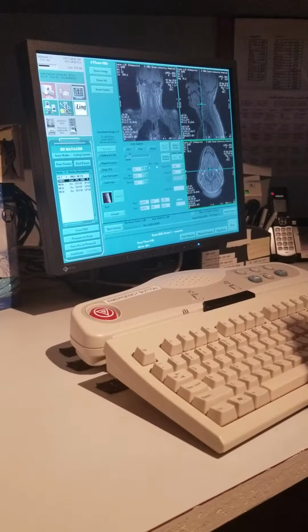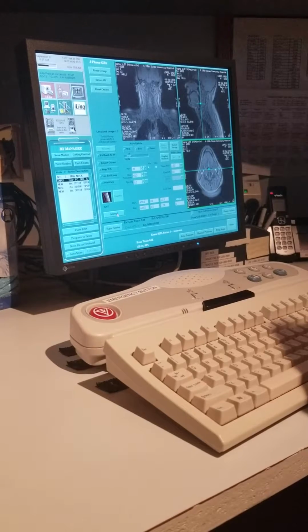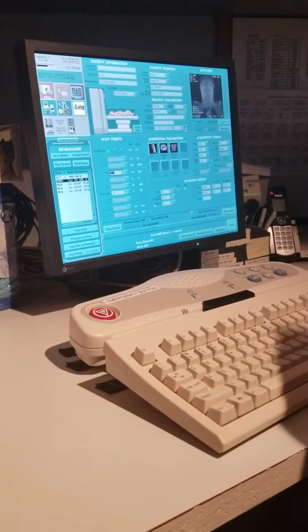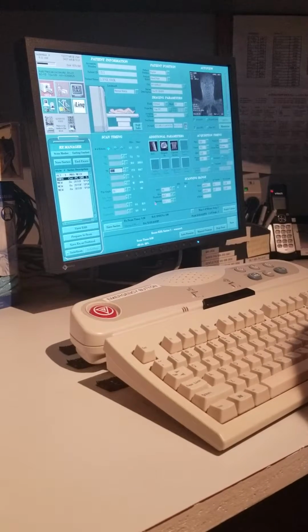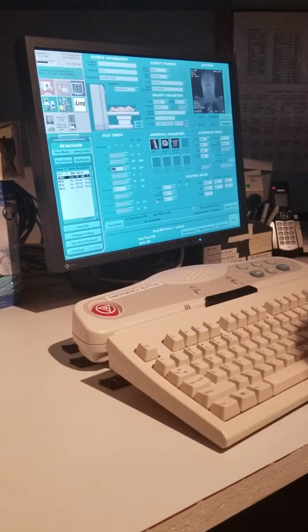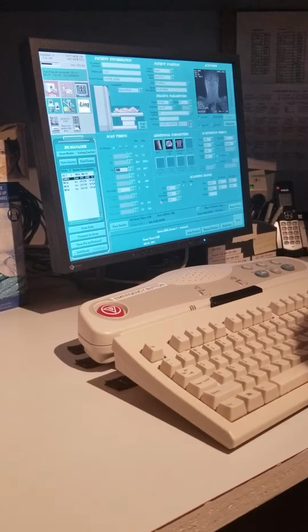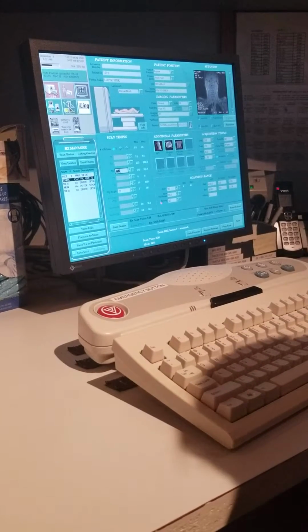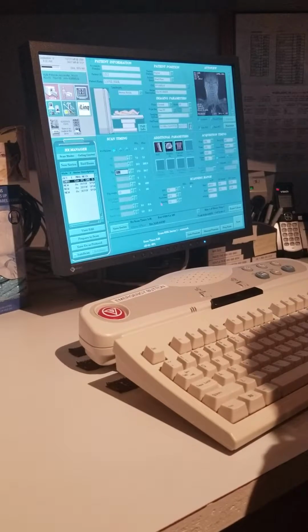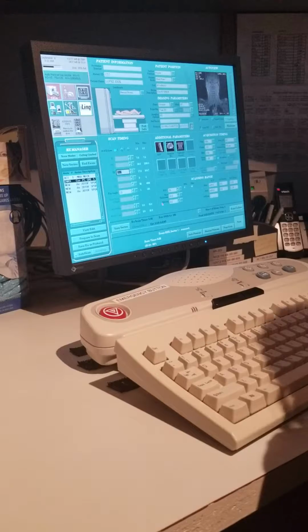And then the sat bands, do we need any sat? No, we're going to give you all flow, so we're not going to sat out any flow. We'll get the arterial and the venous flow. So if we want to see just the arterial flow on a scan of the carotids, where are we going to place our sat band? Remember, the sat is going to suppress the signal for flow coming into the volume. So if the volume's here and the flow is coming off the heart here, we want an inferior sat band. I mean, superior sat band. Sorry.